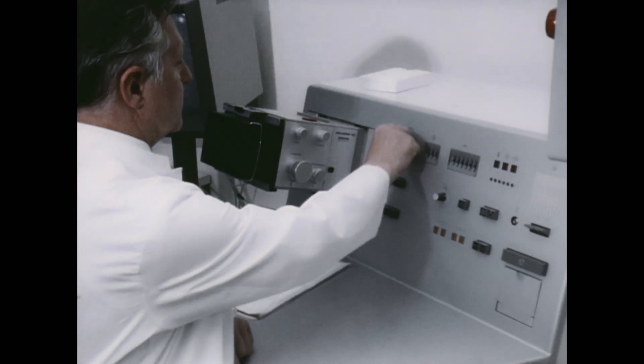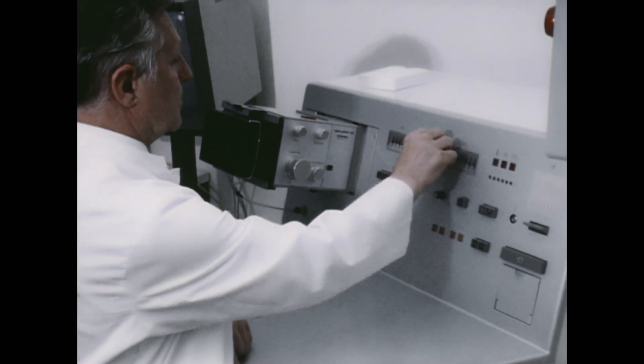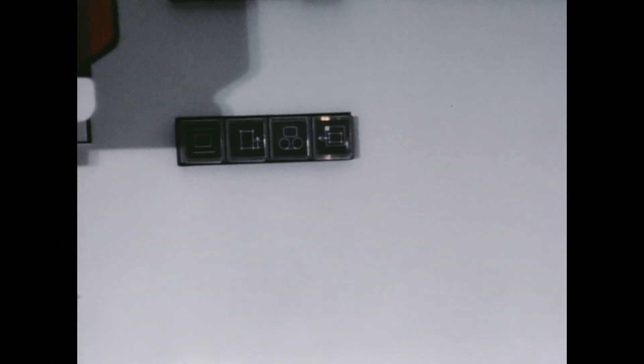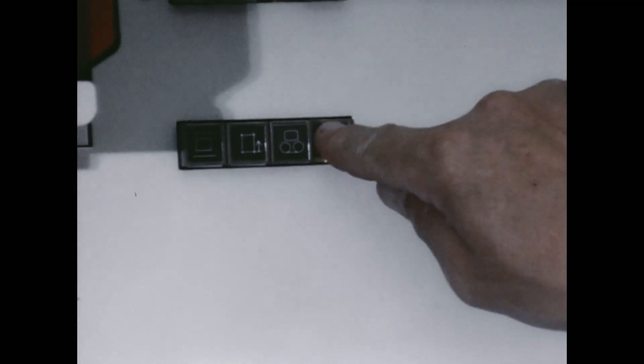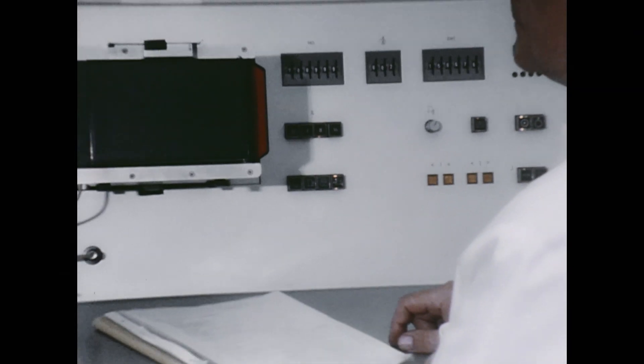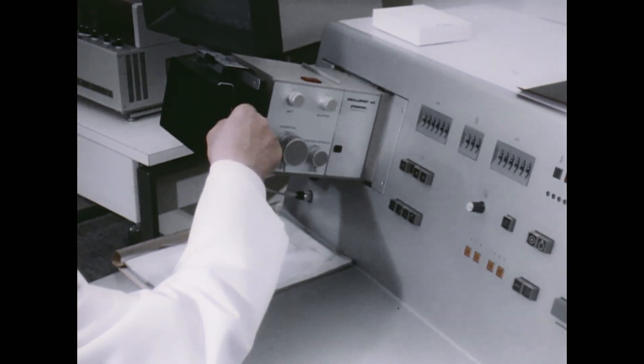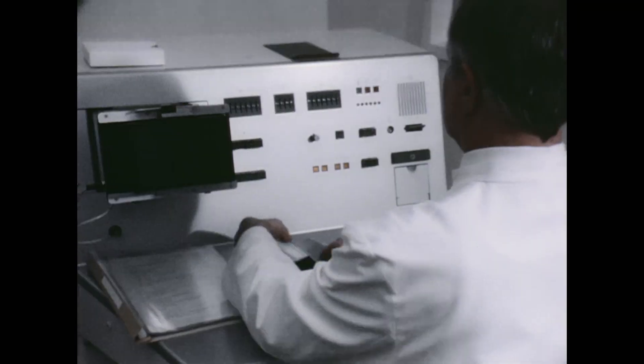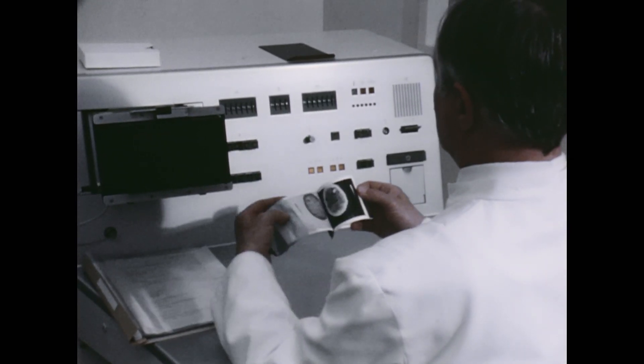The operation of the unit is similar to that of a conventional X-ray unit. Immediately after the examination, the radiologist can view on the screen of the monitor the X-ray image of a tissue layer situated at a right angle to the long axis of the body, a so-called transversal tomogram. The image thus obtained is photographed and used as a basis for the subsequent evaluation.